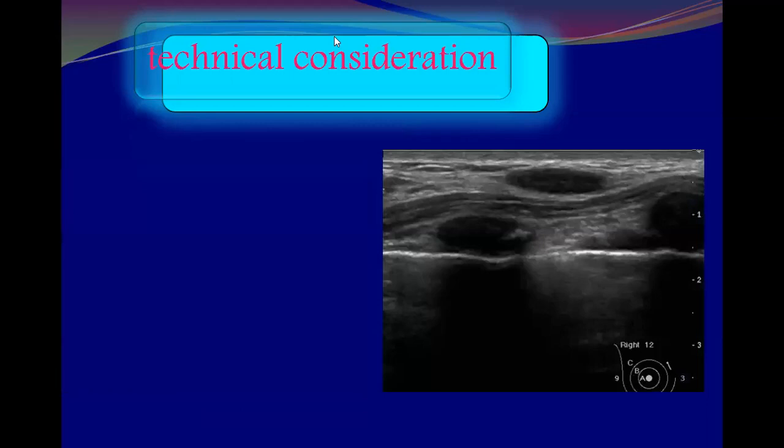Okay, what is going on here? How many lesions do you have? Suhair, how many lesions do you have? One lesion, I think. One lesion. Which one? The one above, in the breast parenchyma, because the two shadowing areas represent the chondro... What about this lesion? What about this? This is not a lesion.